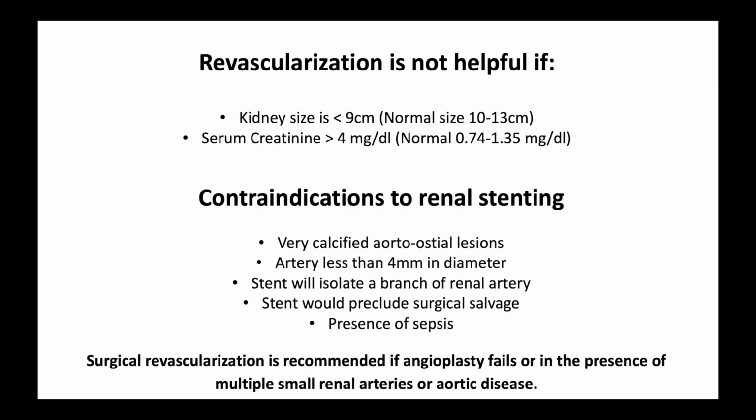There is no point in revascularization if the kidney size is less than 9 centimeters or the serum creatinine has gone above 4 milligrams per deciliter. The contraindications to renal artery stenting mainly are a very calcified aorto-ostial lesion. We've seen an example in a case before.